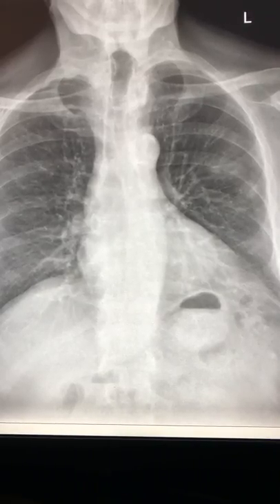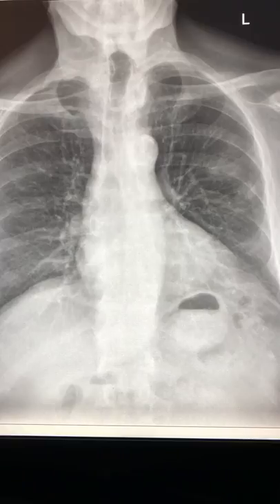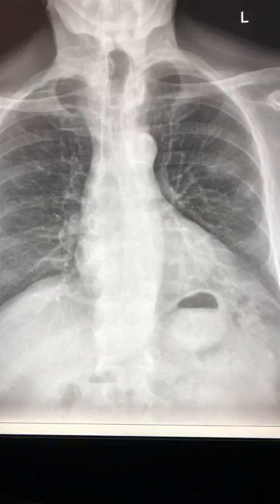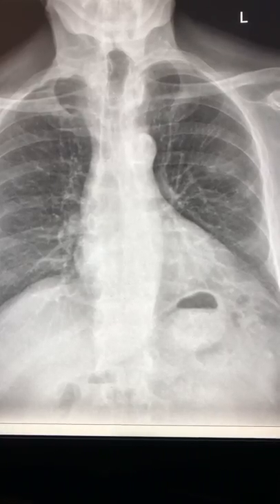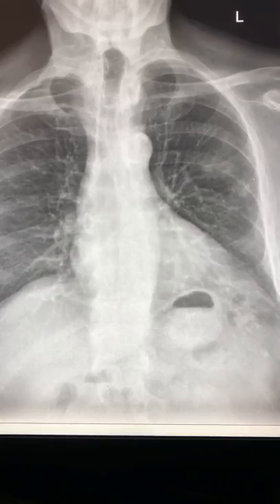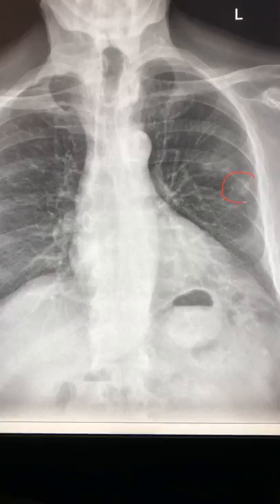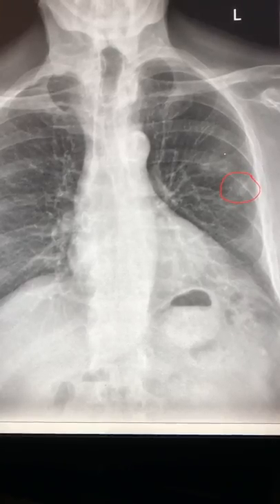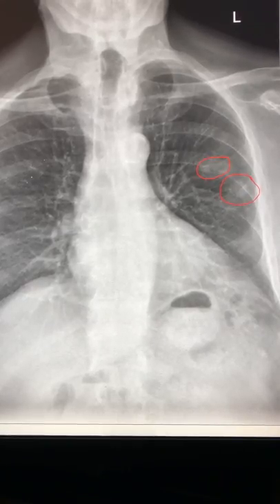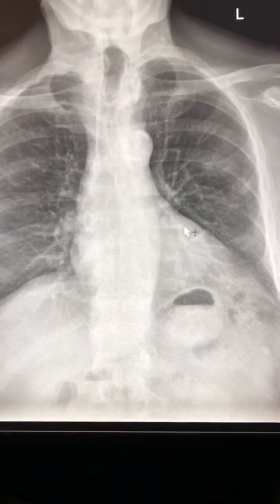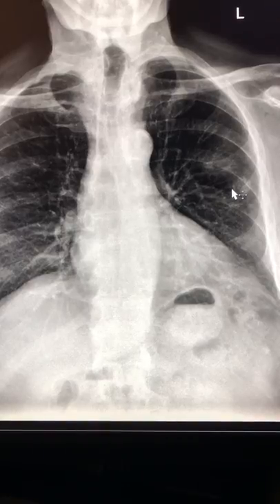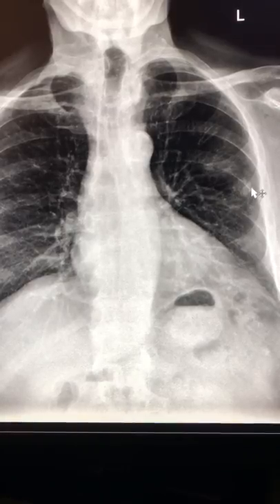This is an example of what a geographic or leaf-like opacity signifies on a chest radiograph. Have a look at this area here on this chest radiograph — I would outline this shadow and also perhaps this area here. We will take the markings away and slightly re-window the settings, and you can see that this has a rather leaf-like, sharply marginated boundary.